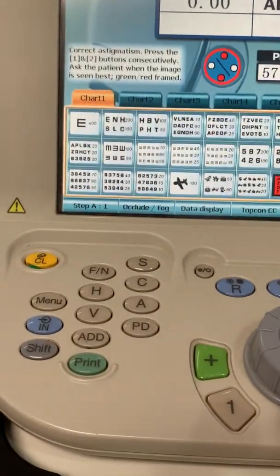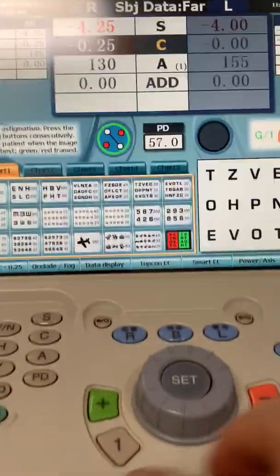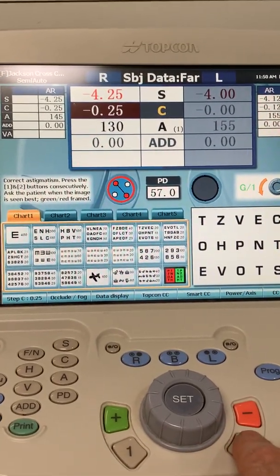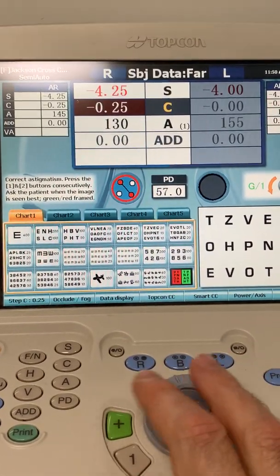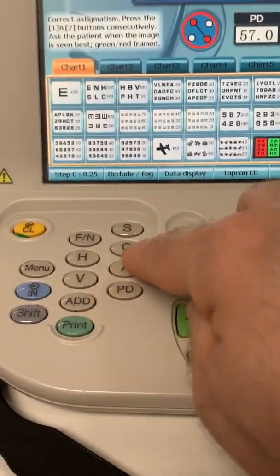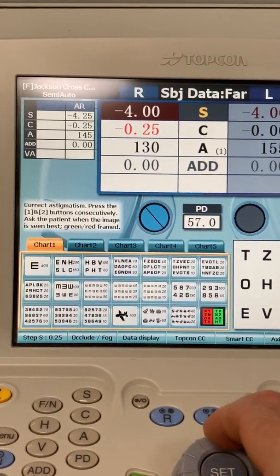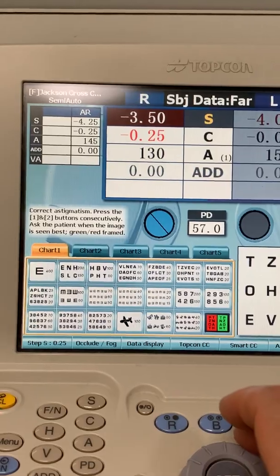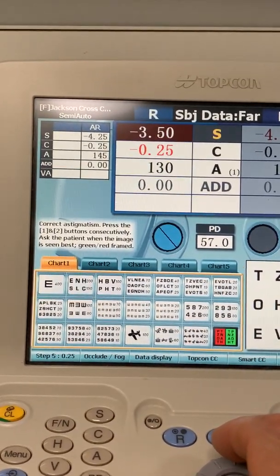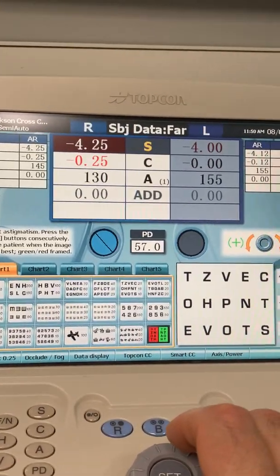Then we can go to the cylinder power and do the same thing — which is better, 1 or 2 — chasing the red, just like we do with the Jackson Cross cylinder. When we're done with that, we hit the sphere button on the console unit and refine the spherical power. We can fog them three-quarters of a diopter and expect them to see around 20/30, then clear it up and expect them to see 20/20, or hopefully even 20/15.